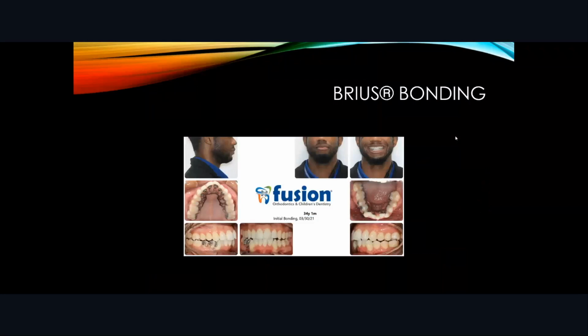Because that lower canine on the right side was not accessible from the lingual side at the beginning, I went ahead and requested a buccal segment to save us some treatment time by derotating the canine while the extraction of the lower incisor was happening, while those other teeth are moving towards the extraction space. And that worked like a charm.